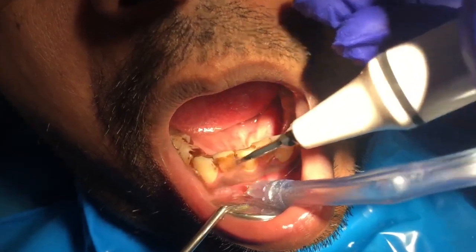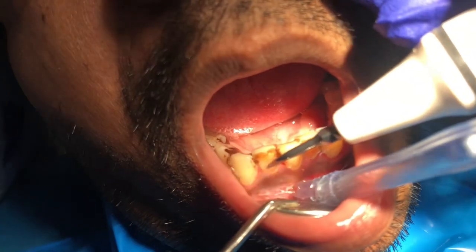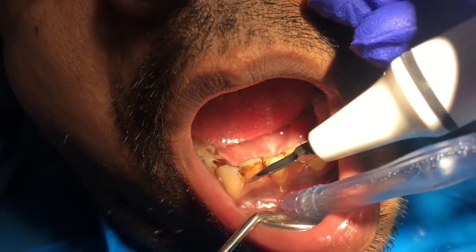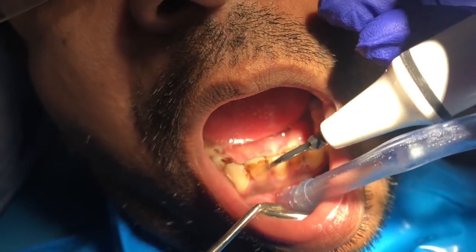You can see it on the other side. You can buy it — it's easily available on mydentistop.com for just 6,000 rupees without GST.